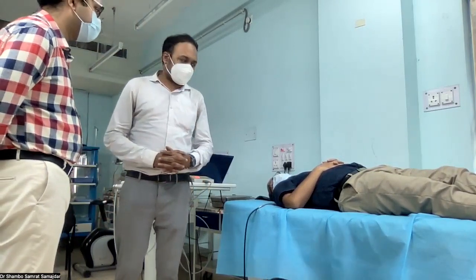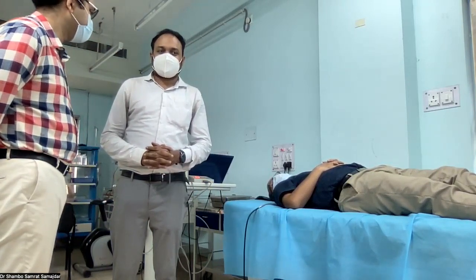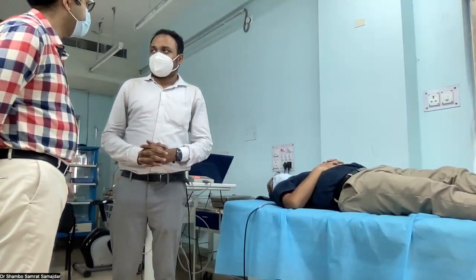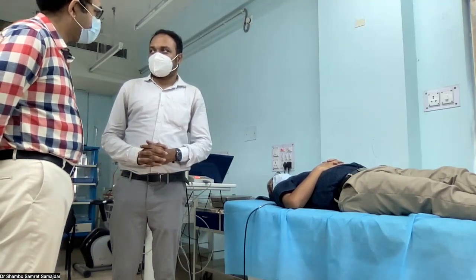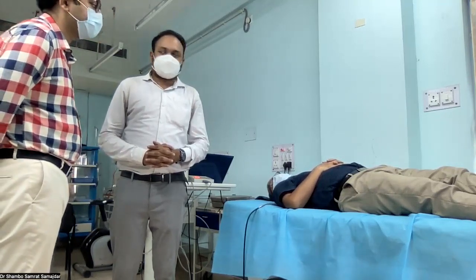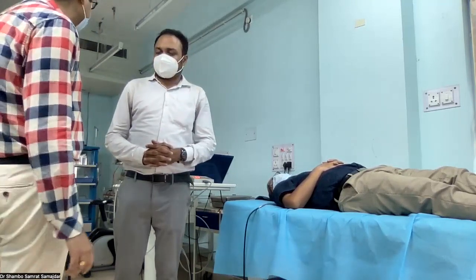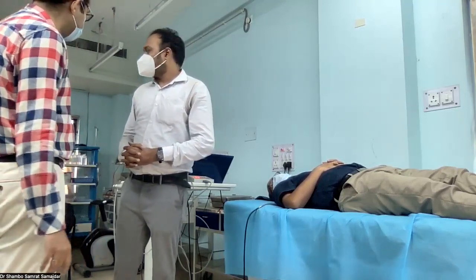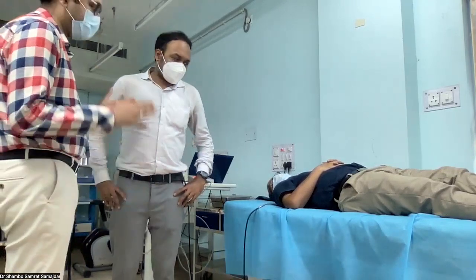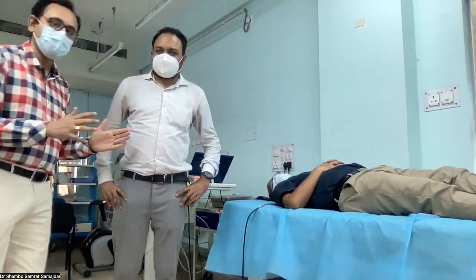Any contraindication to specific procedures like Valsalva, we need to ask, because that is one thing which often requires attention. When we do the Valsalva maneuver, it may produce some heart block like element, bradycardia will be more. So we need to explore whether there is some history of heart block or not. And we should have a proper emergency tray like we have in this lab, with different emergency medications to use in case of any emergency. So this is the basic thing before we start the procedure.